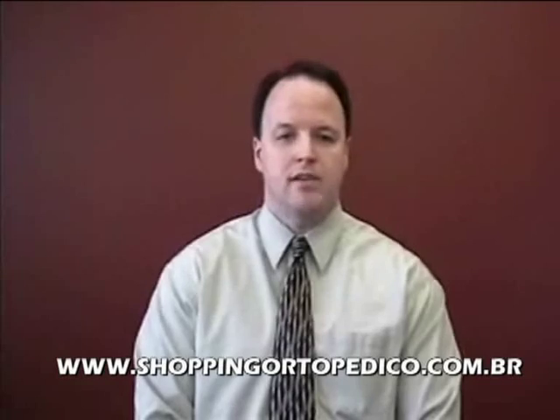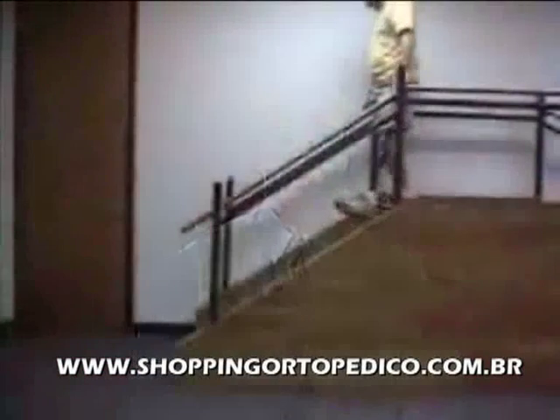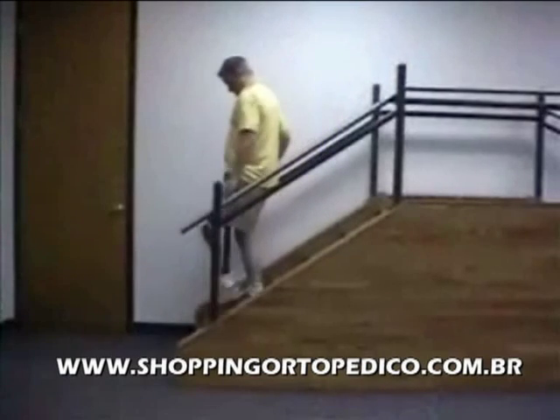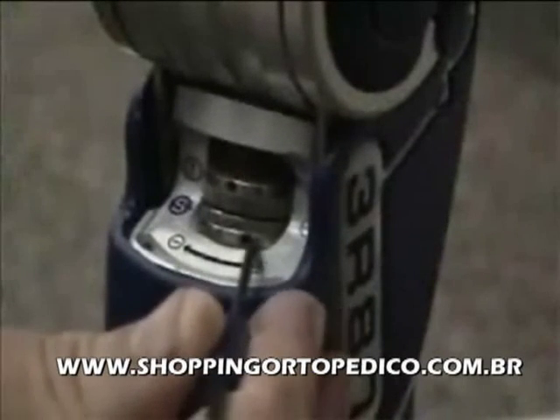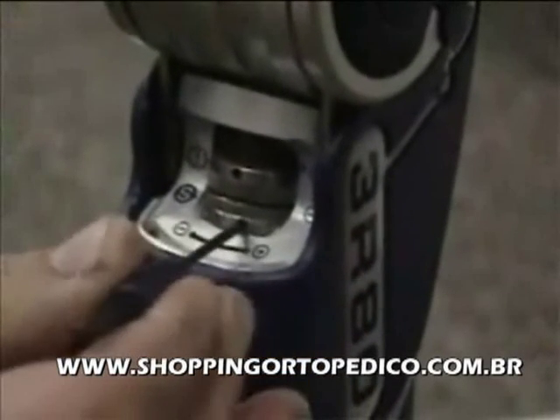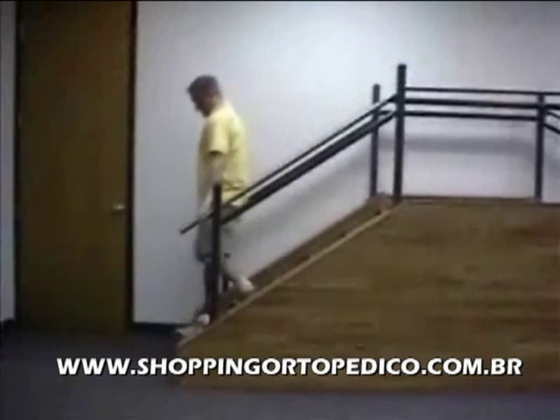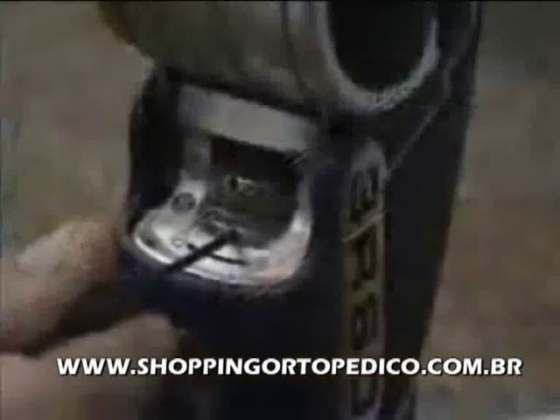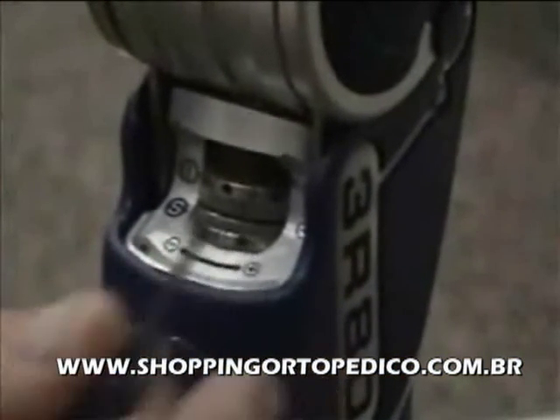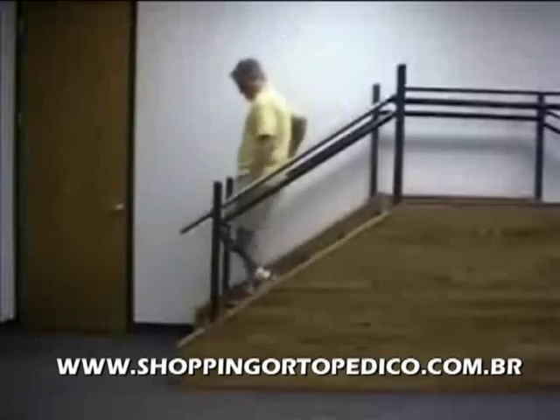On stairs, the patient should have roughly half of the foot off of the stair, and they should maintain good upright posture while letting the resistance lower them down to the next stair. If the setting is too high, the patient will feel that the knee is too stiff and not letting them down to the stair comfortably. To reduce the setting, turn the lower adjustment ring to the left in small increments until the patient feels a controlled descent. If the setting is too low, the patient will feel that they have to rush the sound side foot down to the next stair and will feel a jarring impact on the sound limb. To increase the setting, turn the lower adjustment ring to the right in small increments until a comfortable descent is achieved. Here we can see a good adjustment for the stance flexion damping on the stairs.